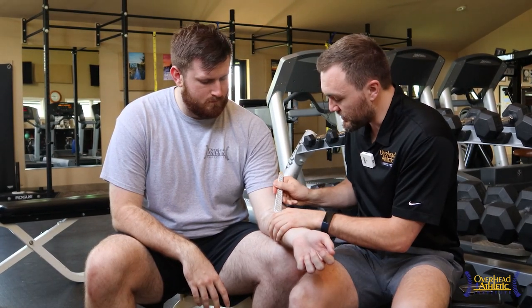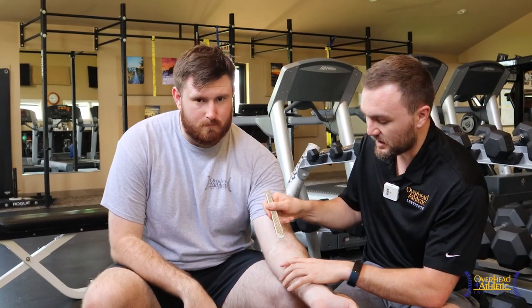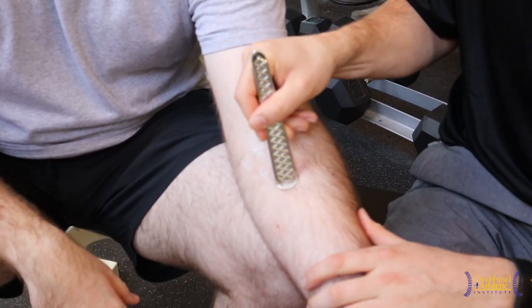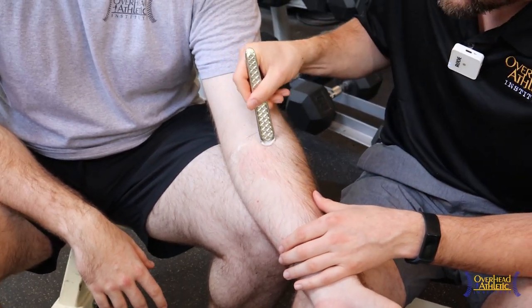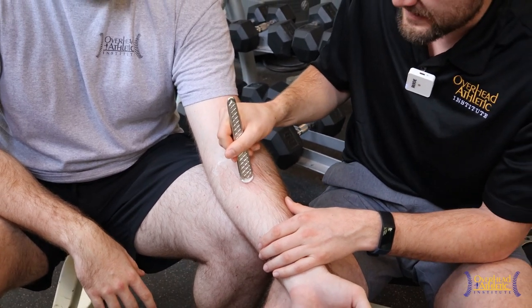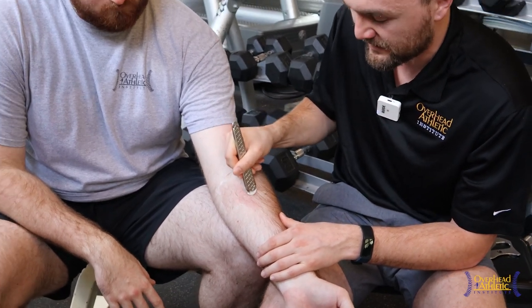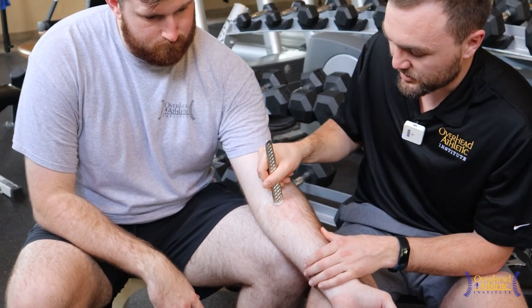Basically what we're doing is we're running down the length of the muscle. I start with the beveled or curved edge, running down the length of the muscle kind of in parallel with the muscle fibers, wherever the soreness is. This is great after a bout of pitching for the inside of the elbow. I push hard on the way down and a little softer on the way back — I'm kind of digging in, but I never lose contact with the skin. I can do quick motions or longer strokes.